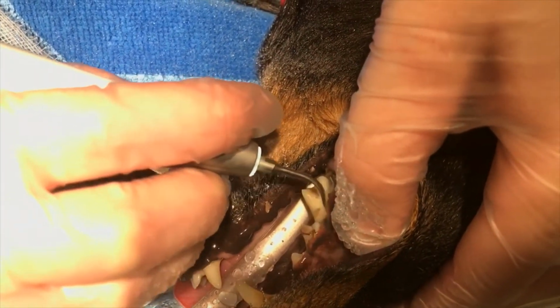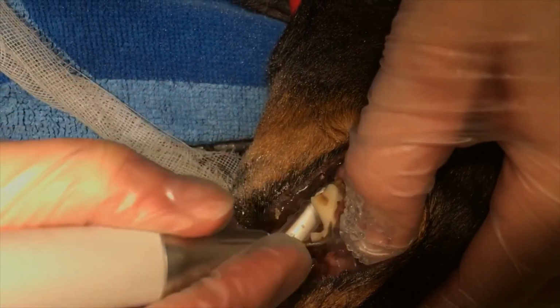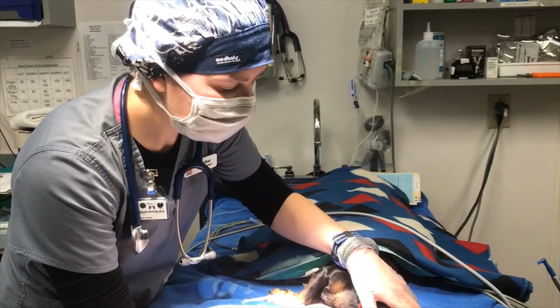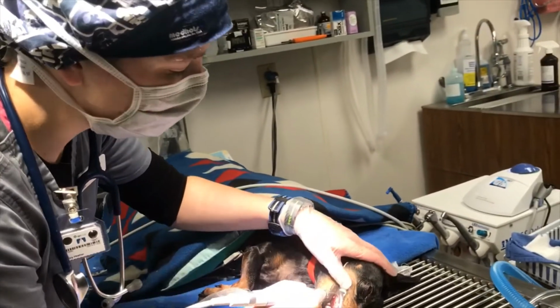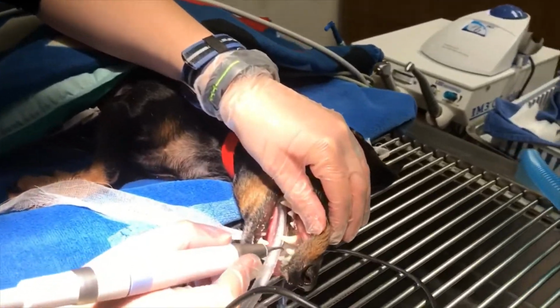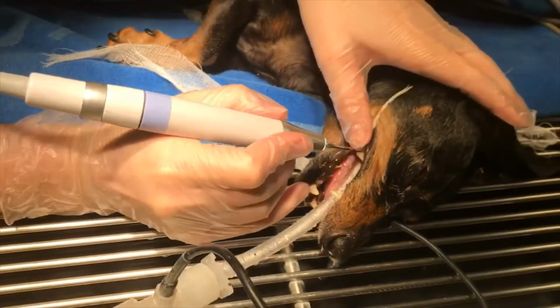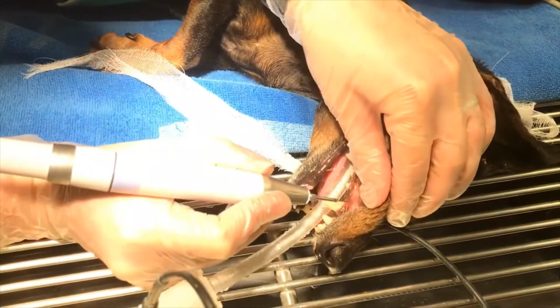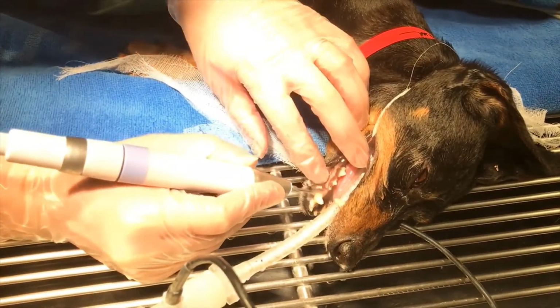There we go. Another thing to note when you're using the ultrasonic scaler is you do want to avoid any soft tissue. You don't want to get the lips in there or the tongue, because that's going to cause damage. We just chattered a little bit, so I'm going to turn this up a smidge. Another thing to note, not all ultrasonic scalers can go under the gum line like I did with this one. Ours is approved for that, so before doing it, you want to make sure that your scaler is approved for going under the gum line.